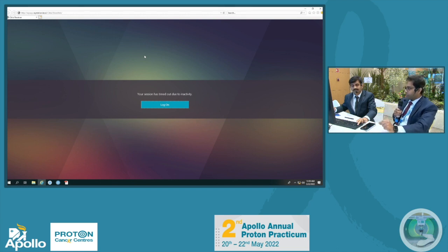And regarding the PTV, I don't want to stress more now. At the end of the session, I will tell you why the PTV should be given or not. We routinely give PTV just for reporting purposes, as ICRU defined. Now, Nofel will tell us the basic steps of proton planning. Please, Nofel.